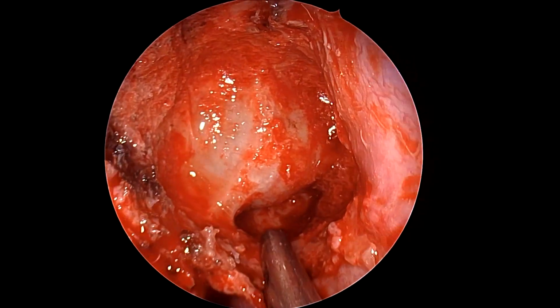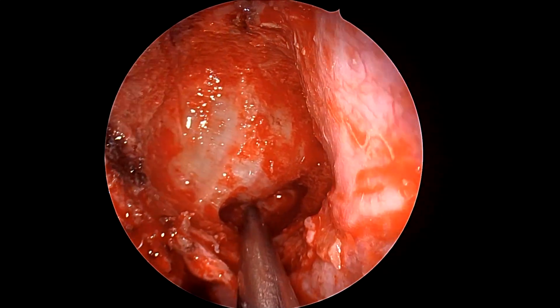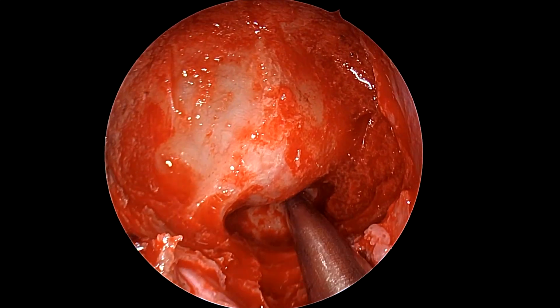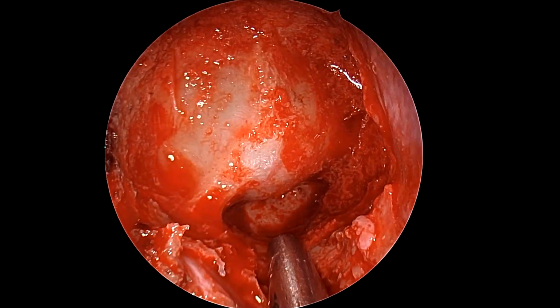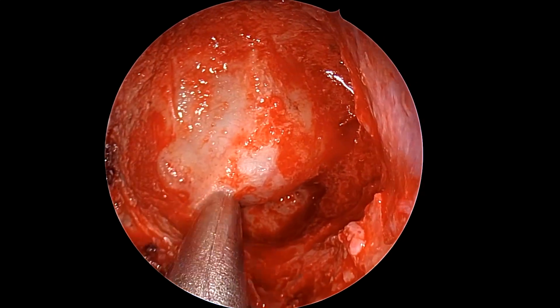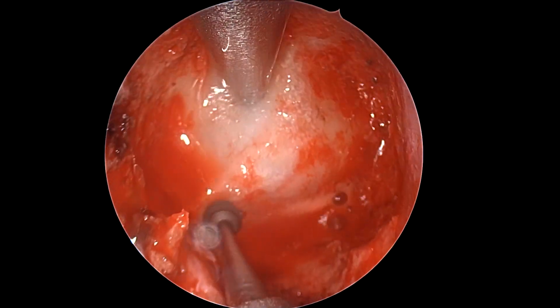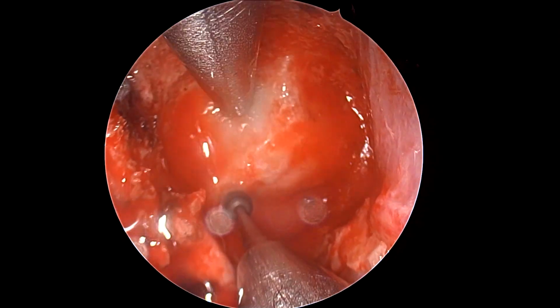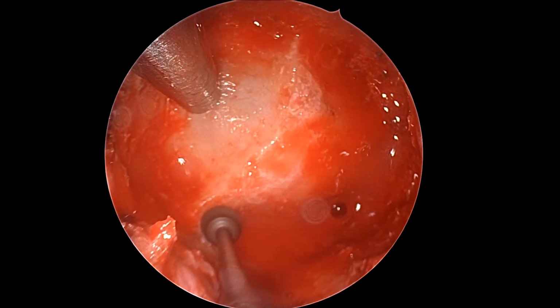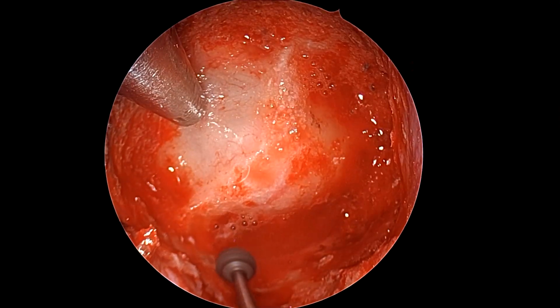Now you see that what we have achieved by drilling is that we have made the clival recess open. You can see the indents of the paraclival carotid on the right side already. We don't have to do much with that, but we can see the completely open and bare clival recess after removing the mucosa from there as well. Back to the diamond burr, and again barely flushing all this bone over the paraclival carotids as well, just for any possible preparation in case we have to mobilize the vessel.